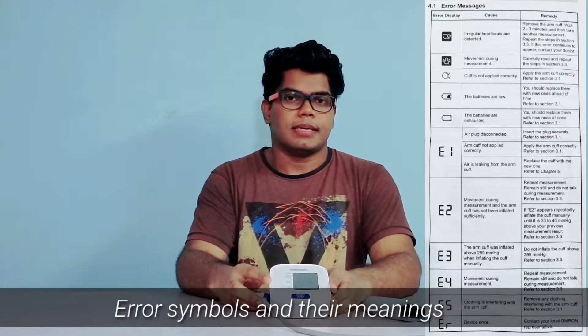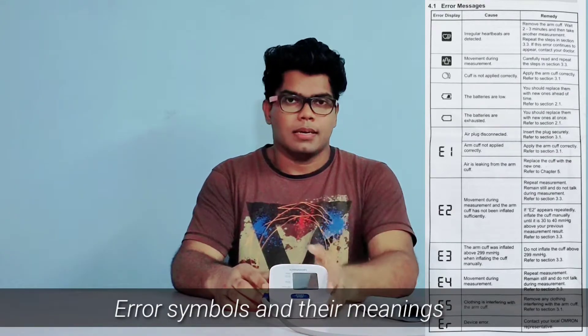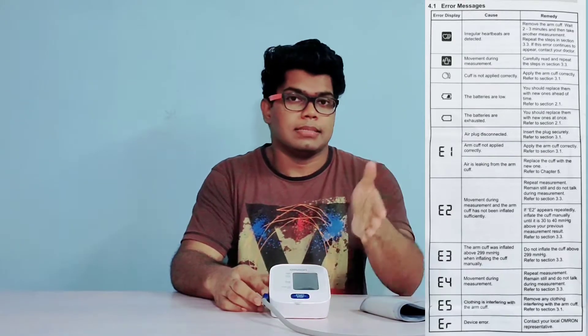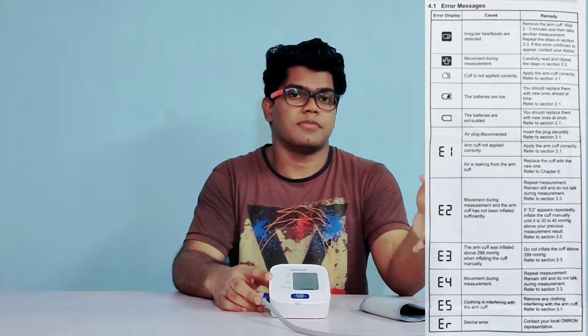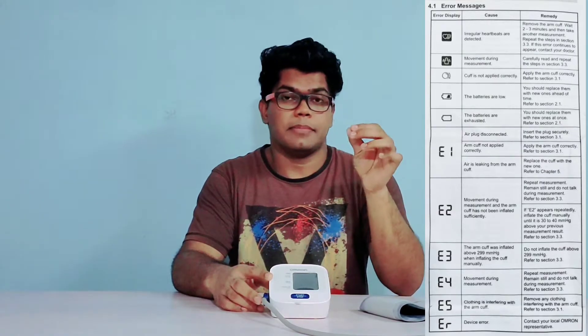Avoid conversations while taking the reading because that may give you wrong values. Here are some error symbols that appear on the device. The first one indicates irregular heartbeat. The second symbol indicates body movement. The third one shows if the arm cuff is applied properly or not. And the last two symbols indicate the battery status.